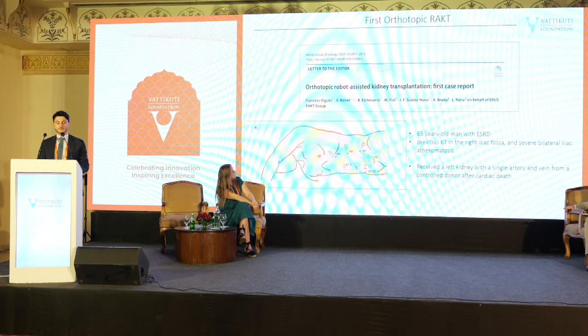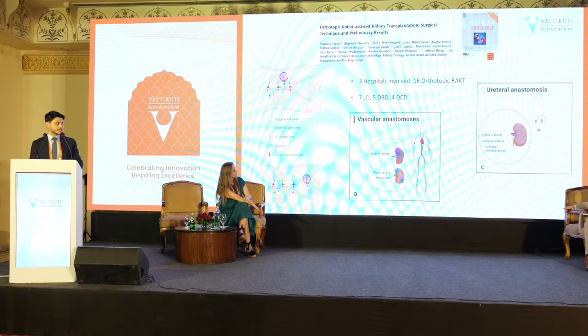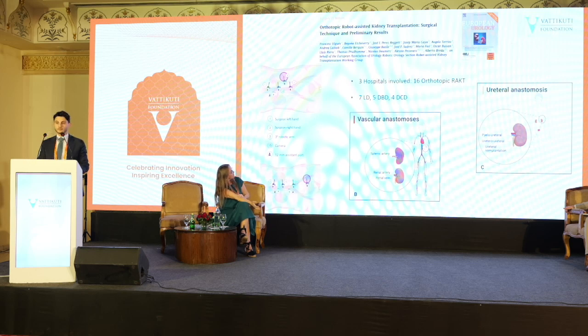The first publication is from 2021 by the group of Professor Vigues, but beyond this first pioneering case, no other publication has been released on the topic. Since last year, we collected the data of 16 cases that have been performed in 3 different hospitals of the ERUS-RAT group. 7 cases were performed using living donors, and about the surgical approach, all cases were performed using a transperitoneal approach with a 4-arm configuration, with a slightly different port configuration depending on surgeon preferences, especially for the gel point positioning.